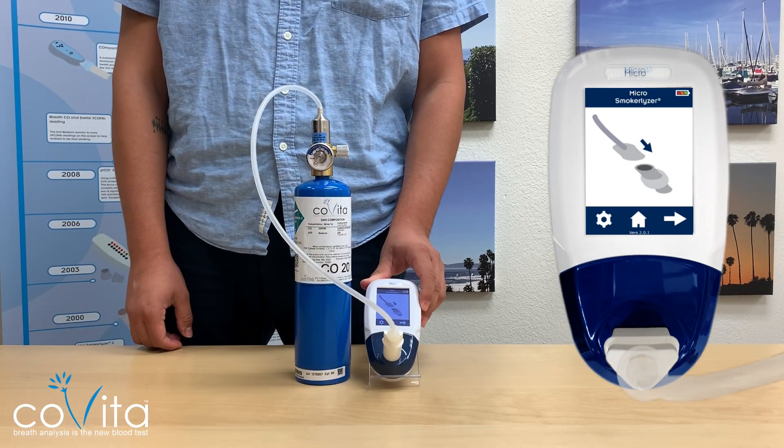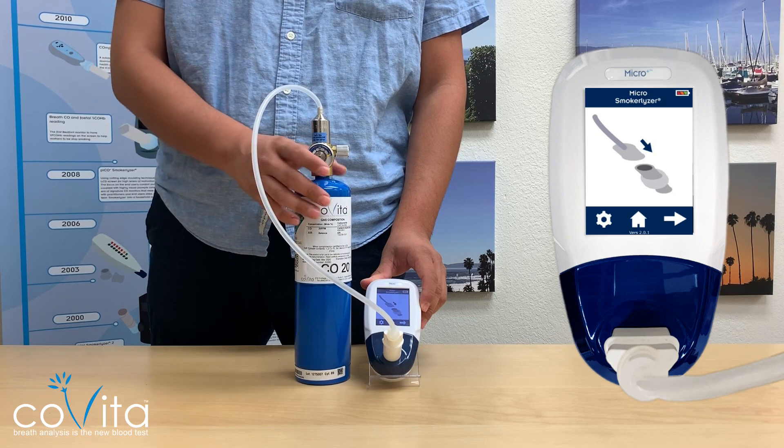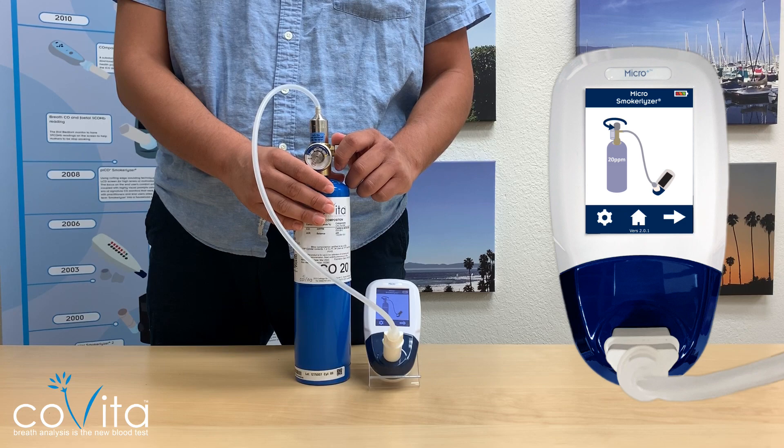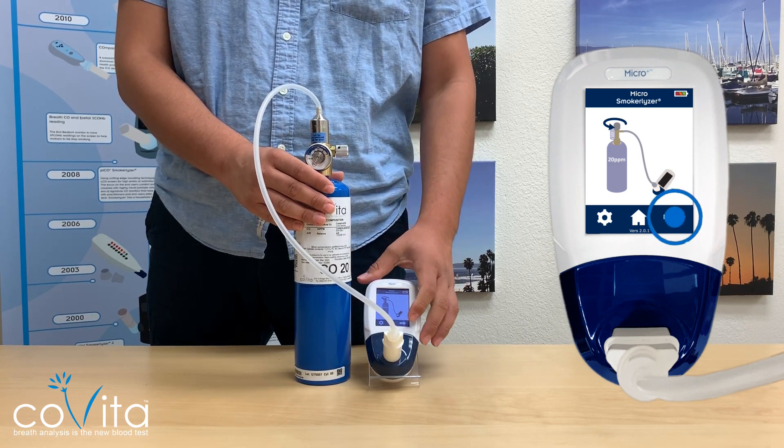Now that the monitor and calibration kit are fully assembled, press the arrow once more to get to the final calibration step. At this point, we may now turn the gas on and press the arrow to begin calibration.